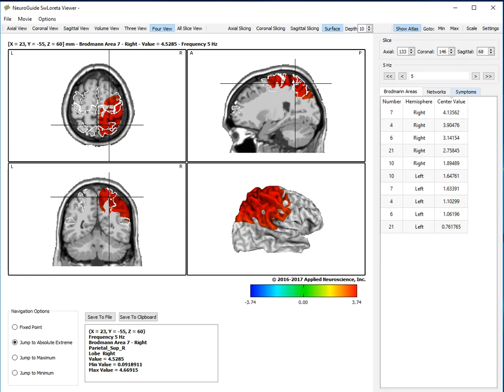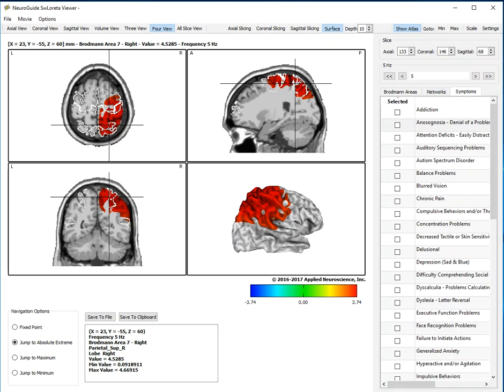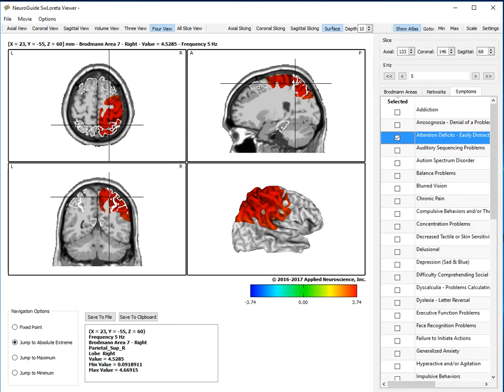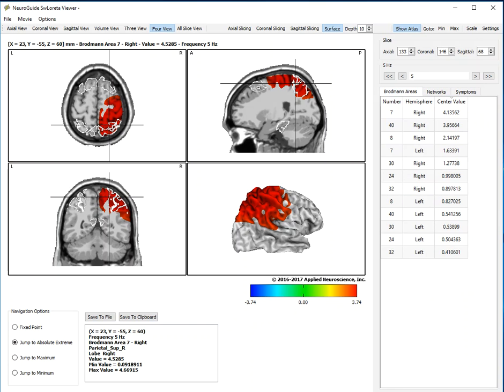We can then also go to the symptom checklist. We can look at attention, let's say, deficits. And that immediately opens up the voxel boundaries for the dorsal attention network. And we can examine the Brodman areas that comprise the dorsal attention network.